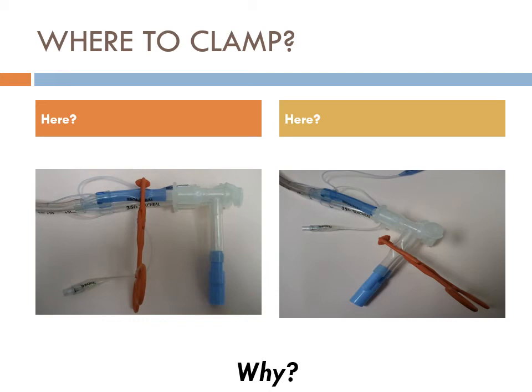If I were to inflate this bronchial, if I were to inflate the bronchial, it's inflated. What am I ventilating? Only left. I have successfully isolated the right lung. I'm only ventilating the left. But now I make it more complicated. You found the 2-to-1 piece. I put the 2-to-1 piece on. What am I ventilating? Two cuffs are up, 2-to-1 piece is on. Both. I'm ventilating both. I haven't isolated anything. I'm losing all my stuff.